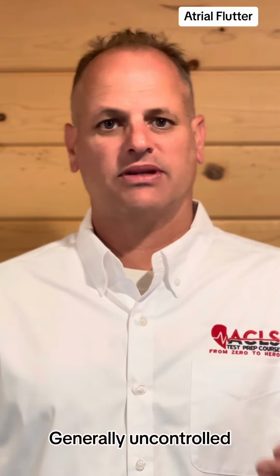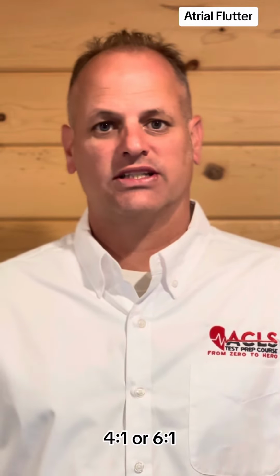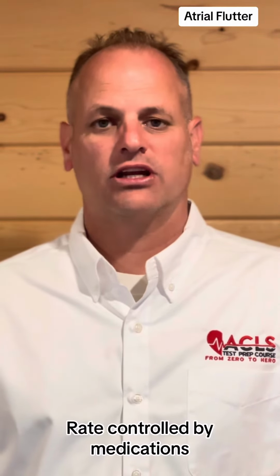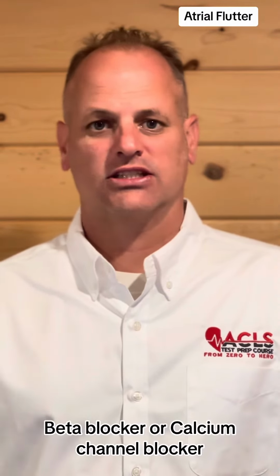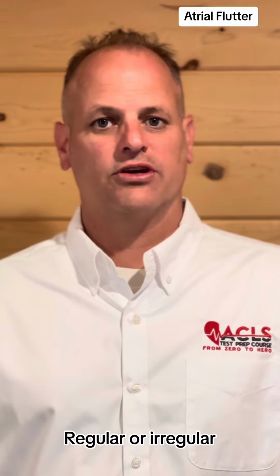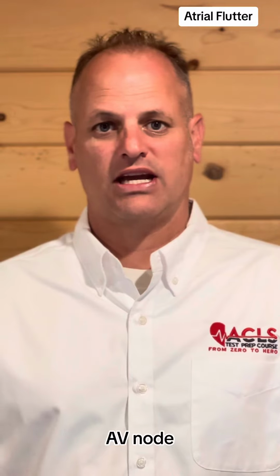Now your ratio, we don't have a P to QRS ratio, we have an F to QRS ratio. A 2-to-1 ratio, something that quick, is generally going to be uncontrolled, whereas 4-to-1, 6-to-1, and even an irregular ratio is generally going to be controlled by medications such as beta blocker or calcium channel blocker. Now overall, the rhythm is regular or irregular, just depending on what the AV node is doing.